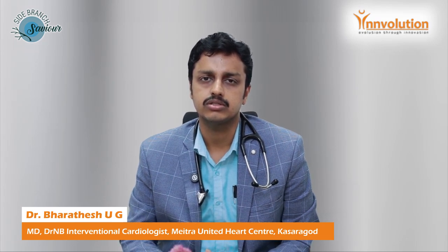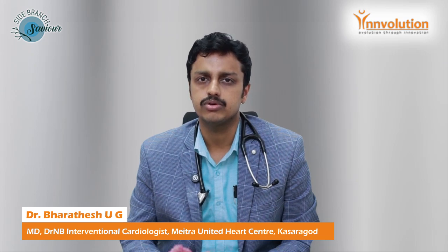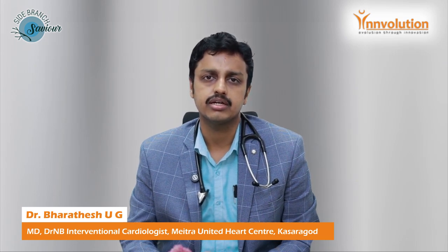Basically, we look for the TIMI flow. If the TIMI flow is not good, if it is TIMI 1 flow, we say it is a bad result. If the TIMI flow is good, that means TIMI 3, then we say there is good expansion of the stent and the stent is well opposed and expanded. So it is always better to have a good TIMI flow, which helps in preventing restenosis.